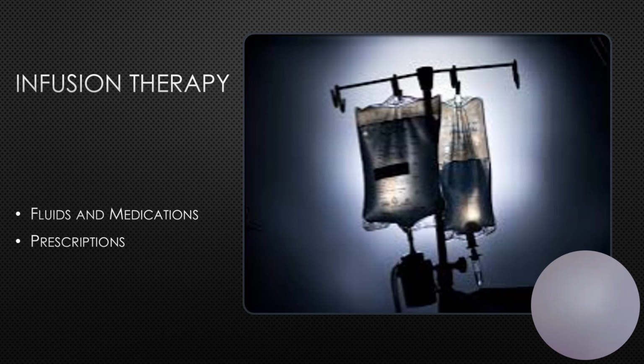The prescriptions for an intermittent infusion should include the route, the solution or medication, the amount or dosage, and the frequency. It can be administered IV push, which is directly into the IV using a syringe, or IV piggyback, where we have a secondary solution container and secondary tubing. It can go directly into a continuous IV infusion or an intermittent device.